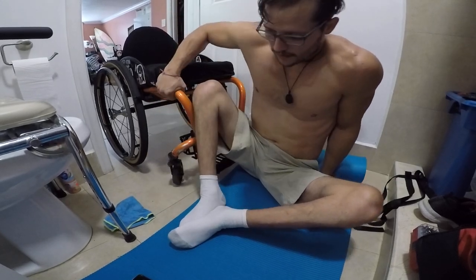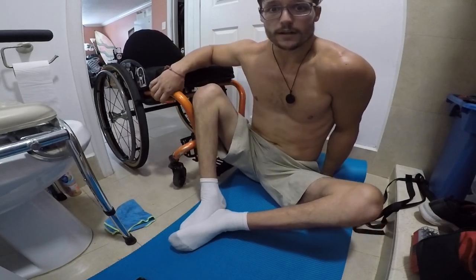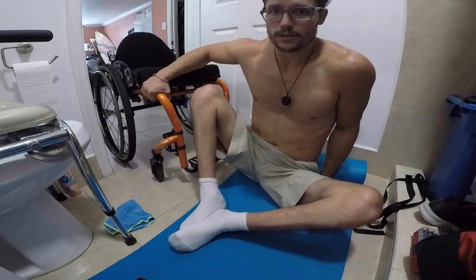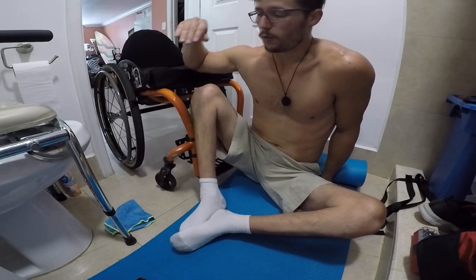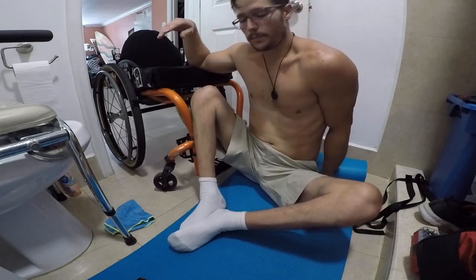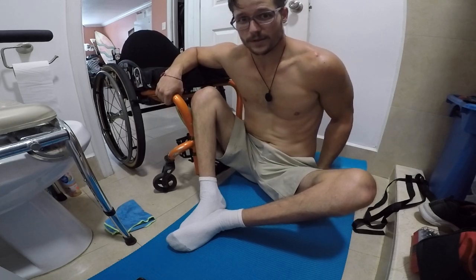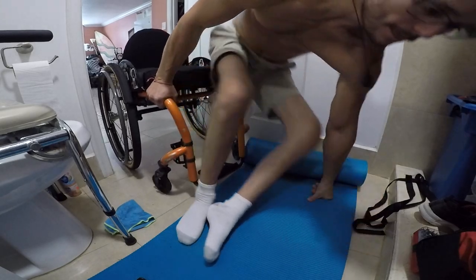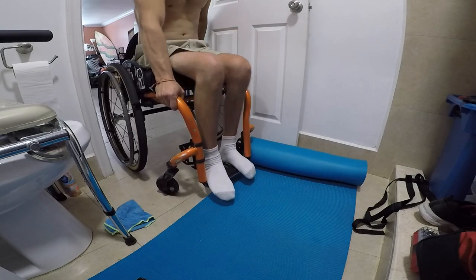I leave my feet there, grab the chair. I have one wheel unlocked so I can scoop the chair under my butt. You can still do it with both unlocked, but it's nice to have one locked so you don't roll backwards when you pop back up. I recommend having your hand as close to your butt as possible — that goes for any transfer.